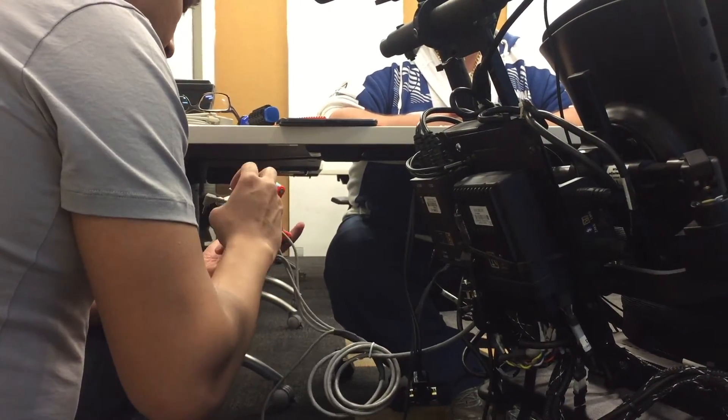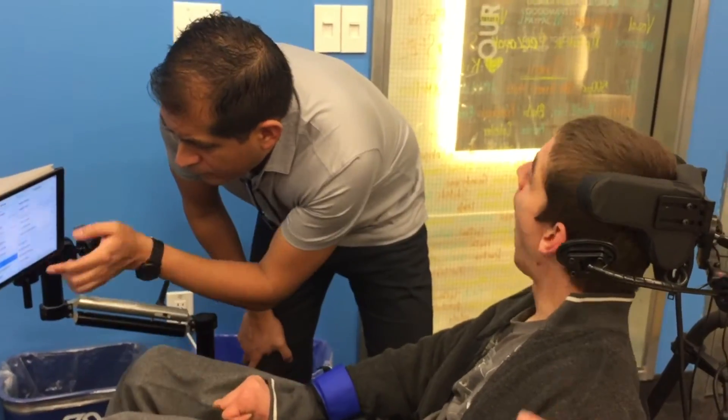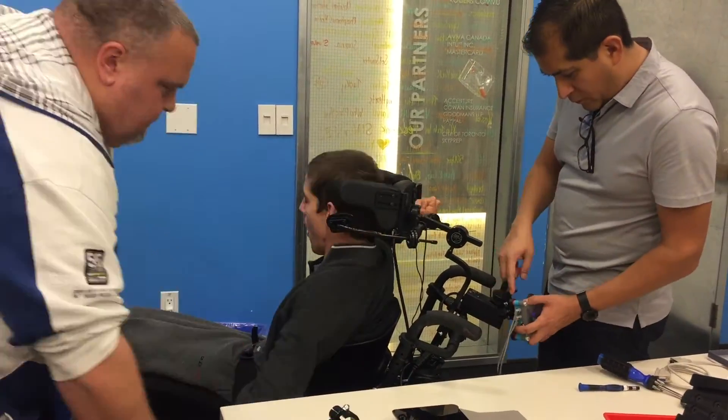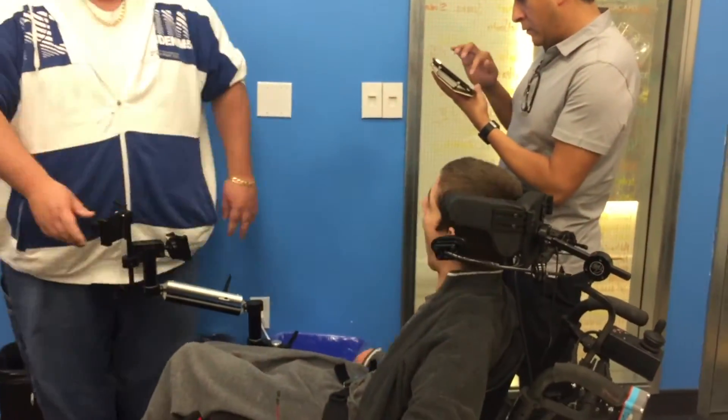The first was assigned on Marshall's iPad as Select, and the other to bring up the scanner menu or to return to the home page when activated. The two remaining independent switch connectors can now be used to connect Marshall's other devices he controls through his wheelchair.